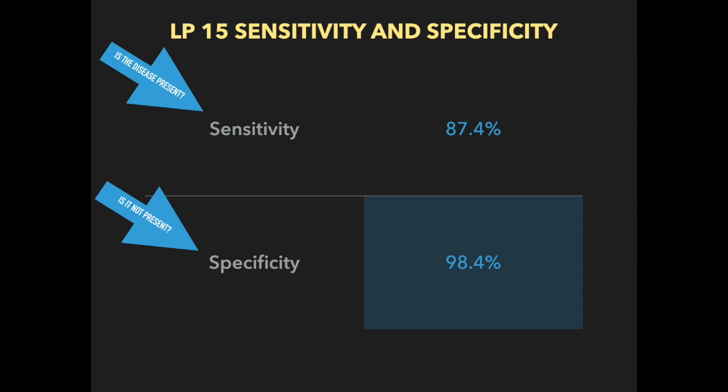So if the computer says that the patient is not having a STEMI, or if it does not give that message, how likely is it to actually not be present? This is kind of confusing, but essentially, if the computer says that the patient is having an MI, then most likely they are. Now, there are causes of false positives, and we'll go over at least one of those.